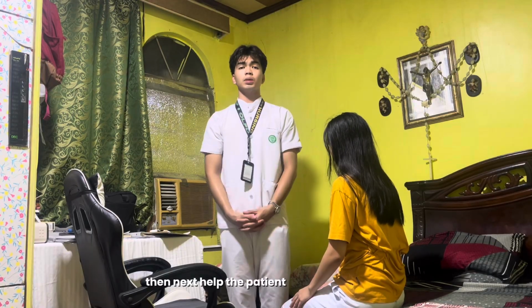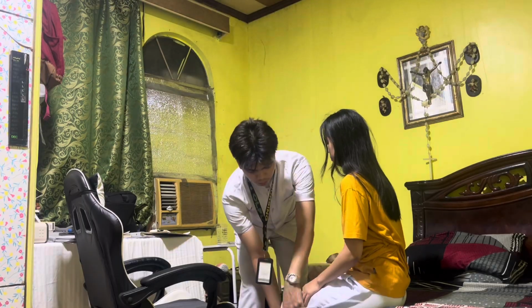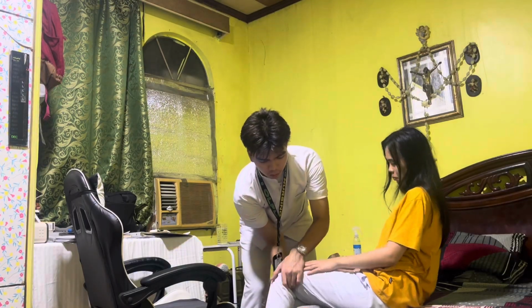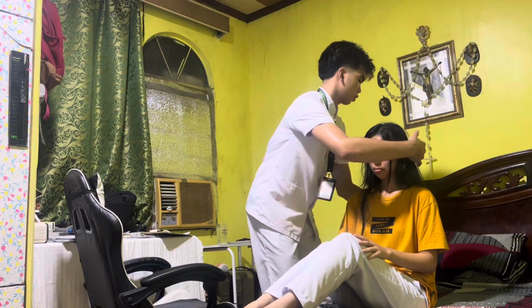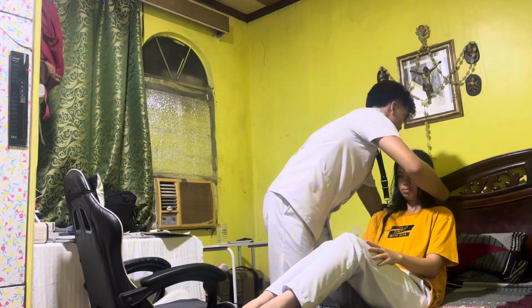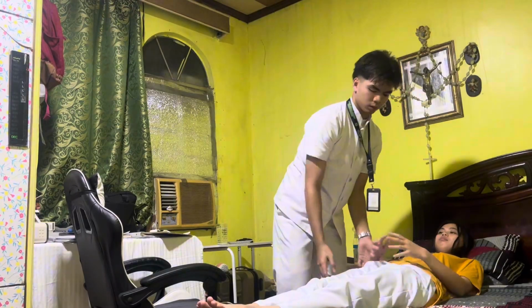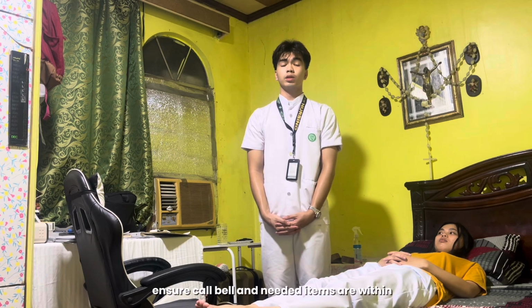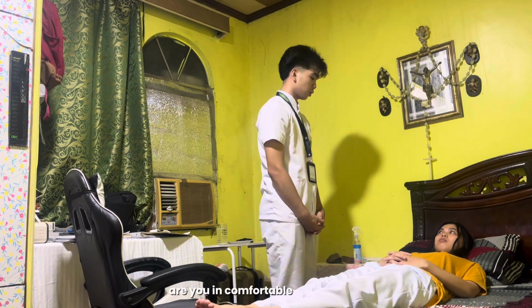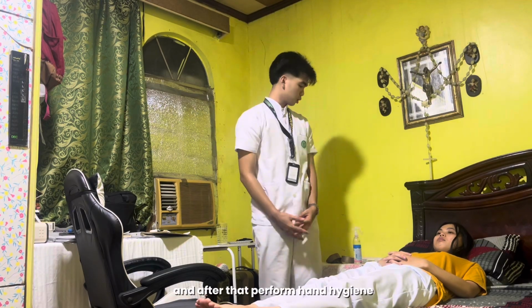Then next, help the patient swing their legs onto the bed and lie down. And after that, adjust the bed for comfort and safety. Ensure call bell and needed items are within reach. So ma'am, are you in comfortable position po ba? Yes. And after that, perform hand hygiene.